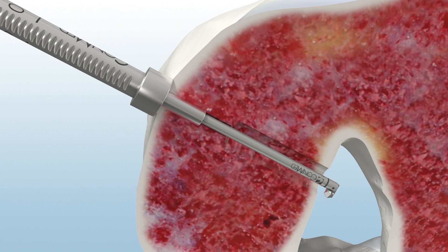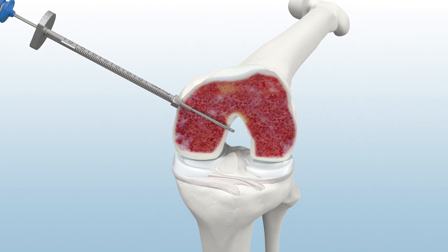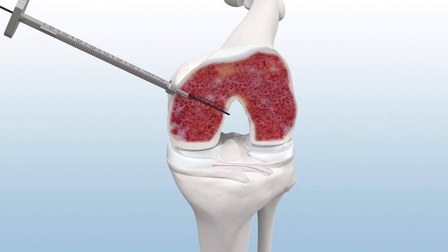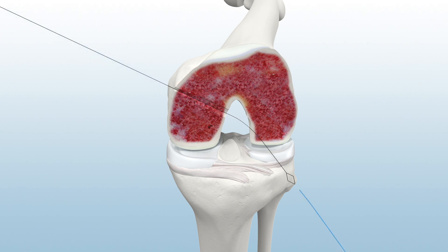Switch the Retro Reamer back to Inline Drill Mode and remove from the joint. To facilitate suture passing, insert the Infinity Suture Shuttle and retrieve the nitinol loop out of the anterolateral portal. Then, load a passing suture.